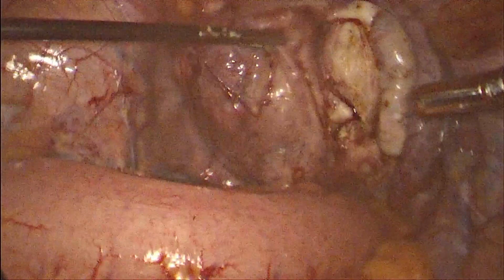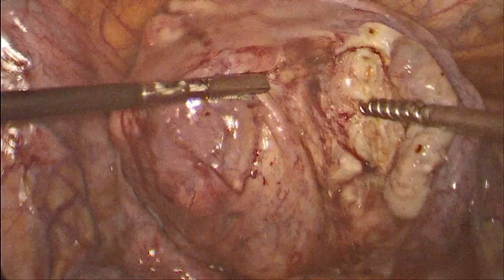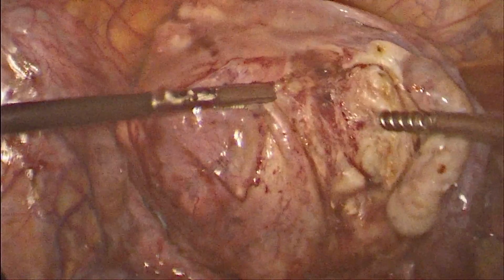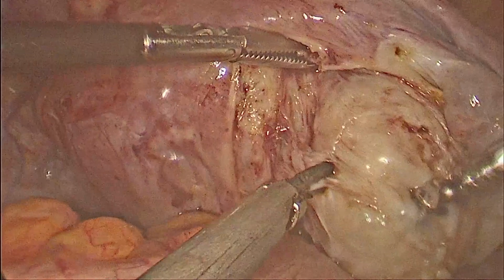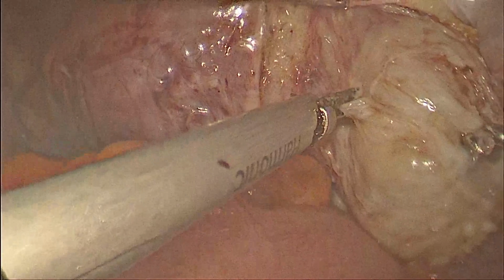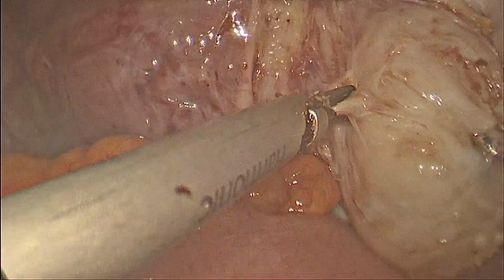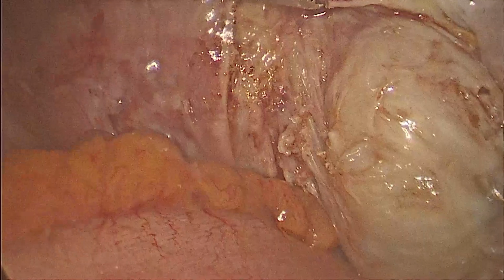Once we take the incision, a myoma screw is used to manipulate the fibroid, and the harmonic scalpel is used to separate the myometrium from the fibroid, so that we can have a clean and shiny myoma coming out.